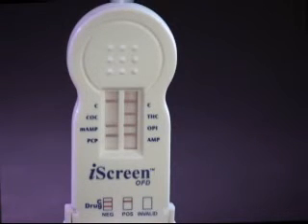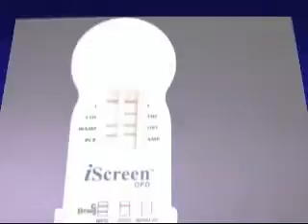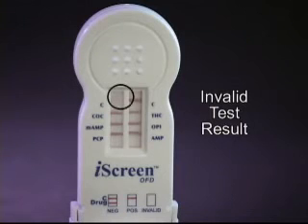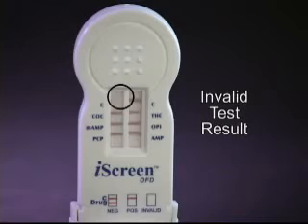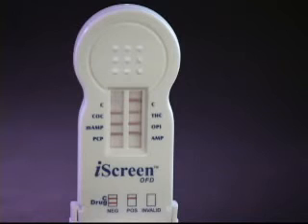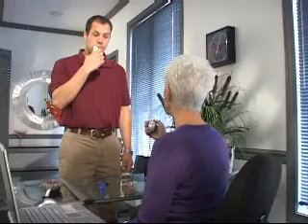It is important to remember to wait the full 10 minutes before documenting the result as non-negative. The last image is an example of an invalid test result, as indicated by the absence of a control line. If at 10 minutes either one or both of the control lines are not visible, then the test must be discarded and considered invalid. All invalid test results must be considered inconclusive, and a retest must be given prior to documenting any result. Invalid results should not be documented.